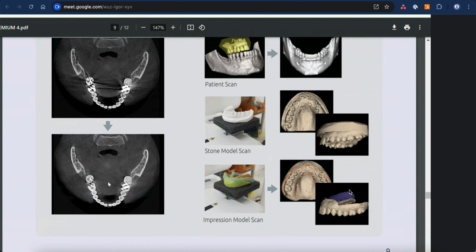For example, some patients can have a porcelain crown, right? Porcelain crown is metal. I can't take the crown out of his mouth just to get an X-ray. Of course, you have gone through the whole process to get a crown or a bridge, which is porcelain, and it has metal. Of course, it will cause some metal noise. So this software has reduced it. Do you see, there's nearly nothing appearing here with the processing of this premium. It reduces the metal noise that can happen.